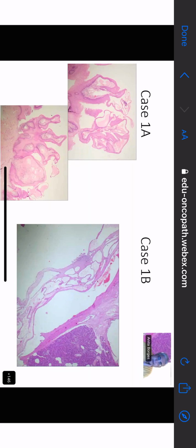Please ask to annotate, and then please use your annotation pen to tell me why these are papillary, because you use that term. Yes, ma'am. I sent you a request. Right. Okay. Now come on.